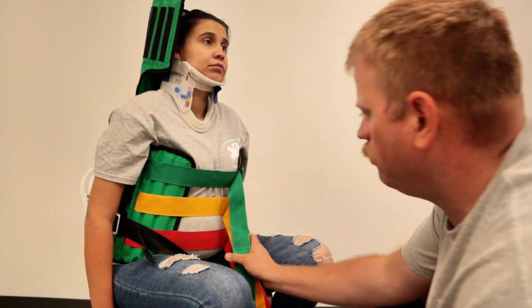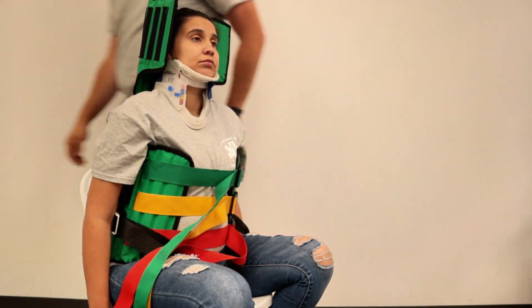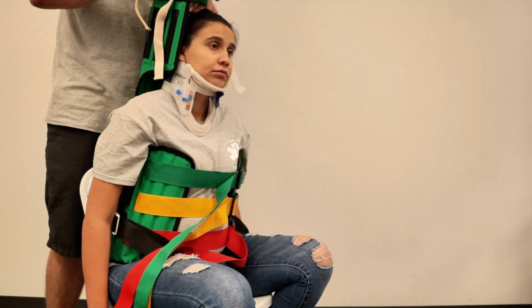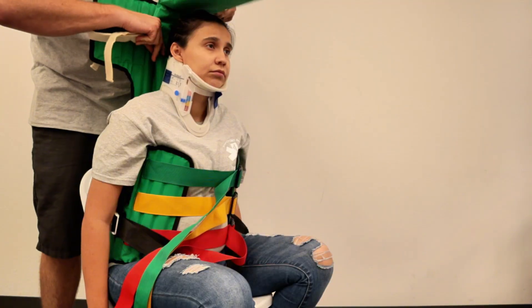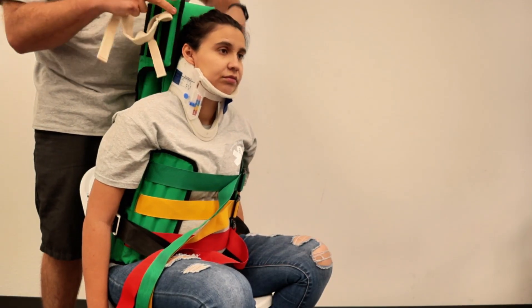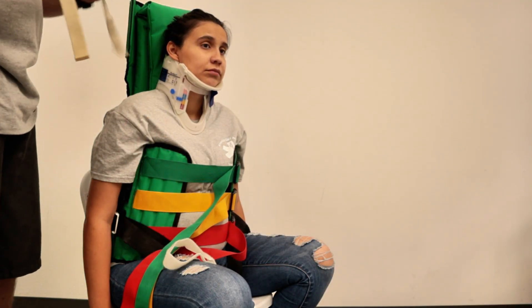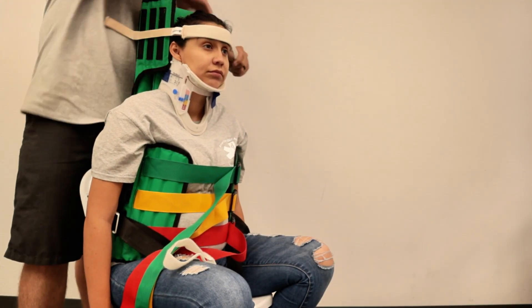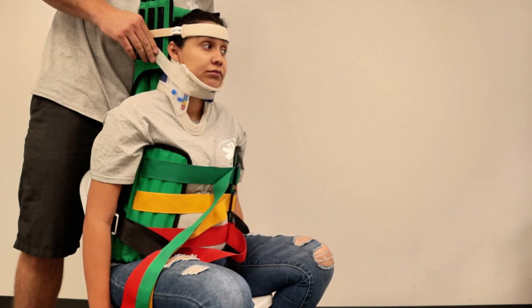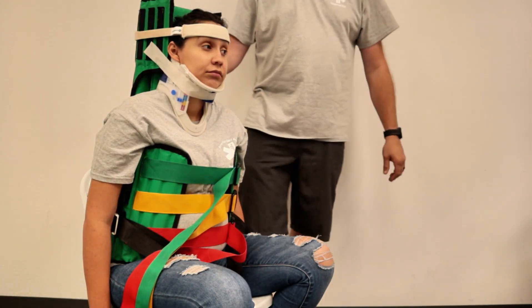Now we've got that nice and tight and we bring our straps over. With the person still holding the head, we can go ahead and secure the head and neck. We bring this cushion — depending on how far forward, sometimes you can just slip just the top half, or if need be, we can fold it in half. We take the head pad here and we can take another one for the chin and secure there if needed and if that's comfortable for them. Once fully secured, the person holding the head can let go.